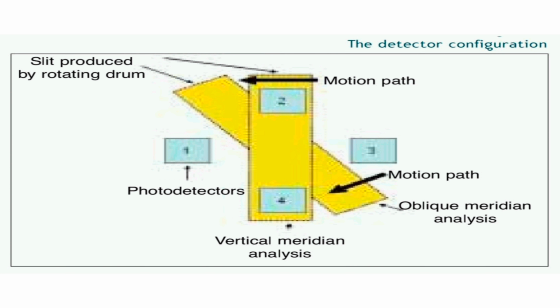The system detects that the vertical meridian is measured by the way each detector senses the slit as it passes over the pupil. The time differences from the slit reaching each of the detectors allow the AR to detect the meridian under investigation. The oblique slit will likewise initiate different time-dependent responses from the detectors and thus derive the power within the oblique meridian.